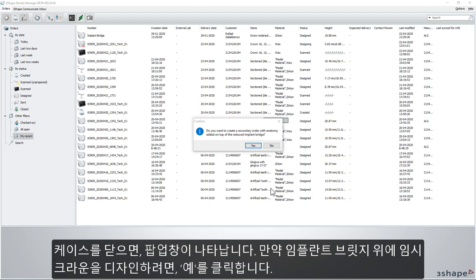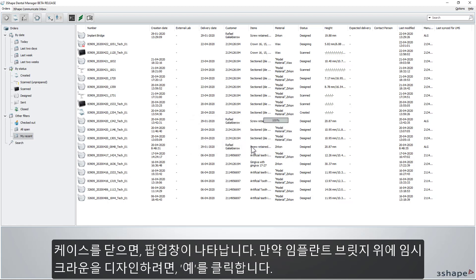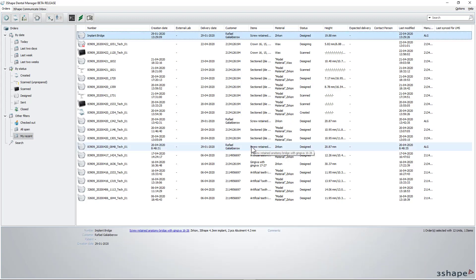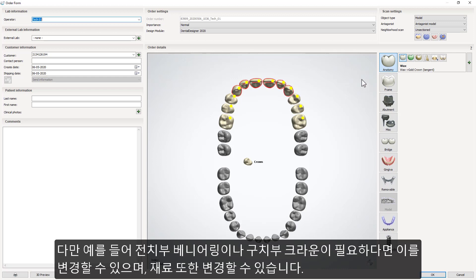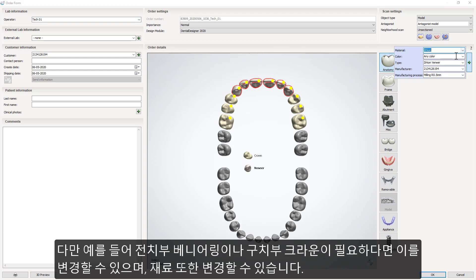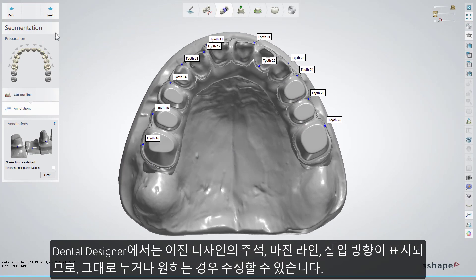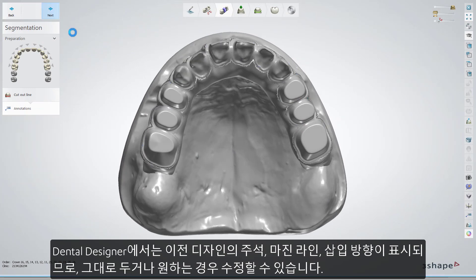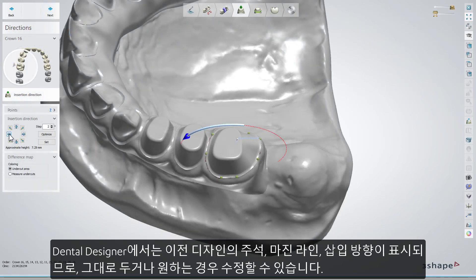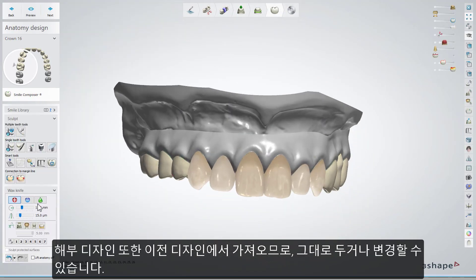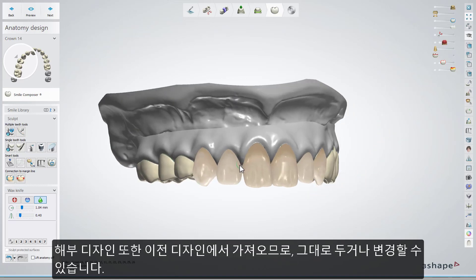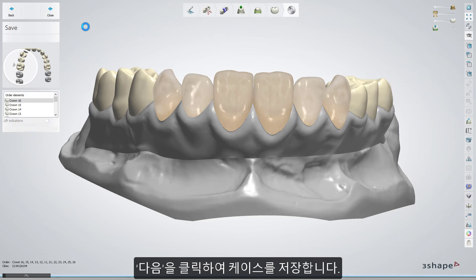You will get a pop-up message after closing the case. If you need to design immediate crowns on top of the implant bridge, choose Yes. The new order form will appear — crowns will be automatically created on each tooth based on the primary order form, but it can still be modified if you want to have, for example, veneering on the anterior teeth and crowns on the posteriors. The material can also be changed. While in Dental Designer, the annotations, margin lines, and insertion direction will be taken from the previous design, so you can leave it as it is or make some modifications. The design of the anatomy will also be automatically taken from the previous design. Click Next to move to the final step and save the case.